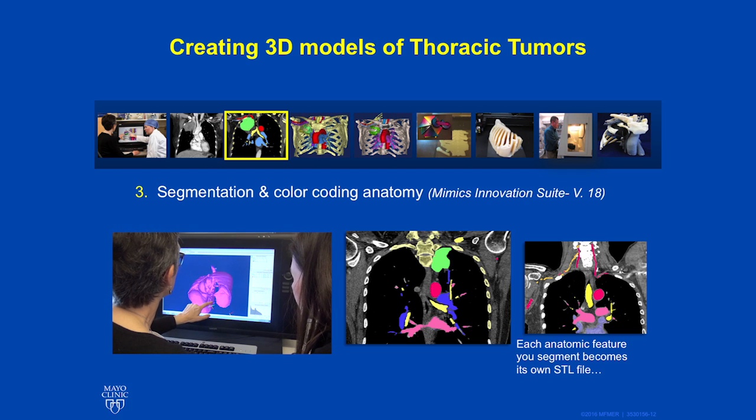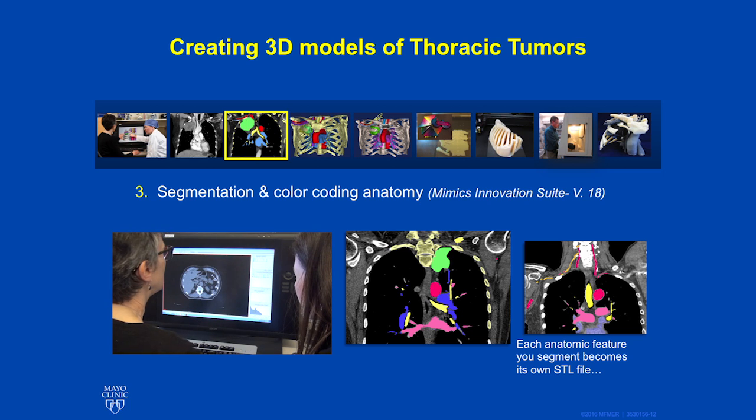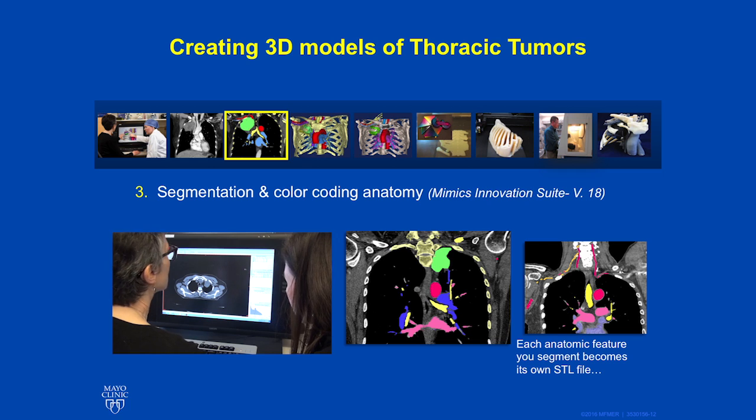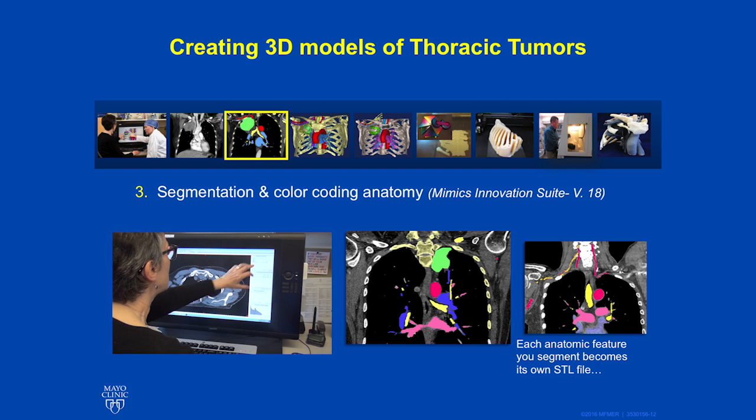You can select dense bone for chest, aortic contrast, air, or certain soft tissue density. Thresholding is when you actually pick a certain Hounsfield value and then clean that image up. There are a dozen different tools you can use to segment different structures. Thresholding is one. Another is region grow. Region grow highlights contiguous structures and allows you to select something such as air, and everywhere that air connects is highlighted, as seen in the image on the far bottom left.